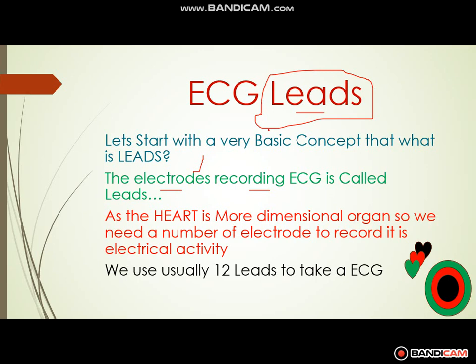As you know, the heart is a three-dimensional organ, so we need a number of electrodes to record the electrical activity of the heart. Usually there are 12 leads we use in ECG to record the ECG of the patient.